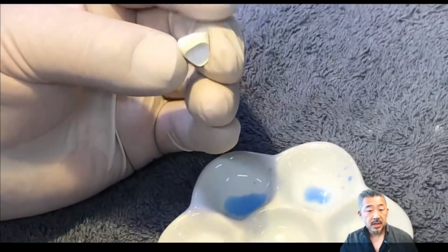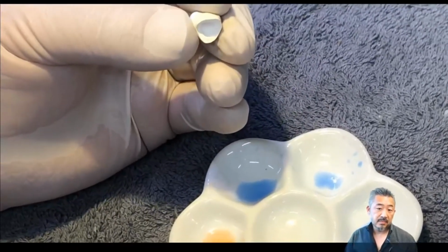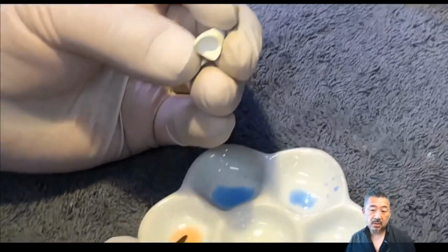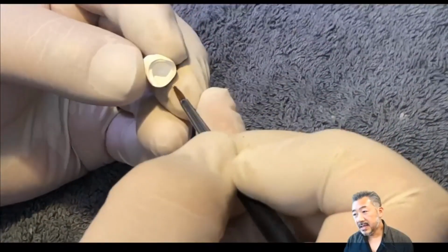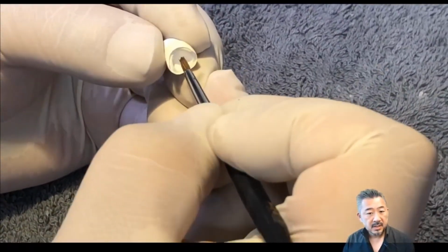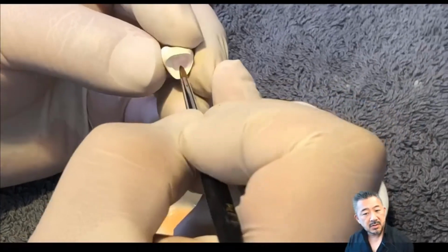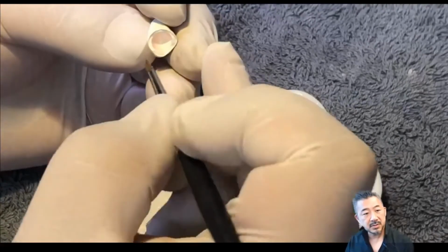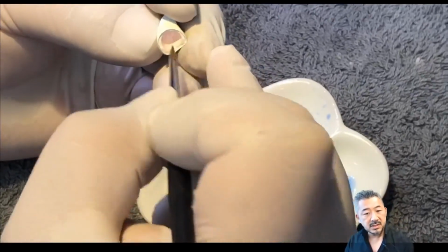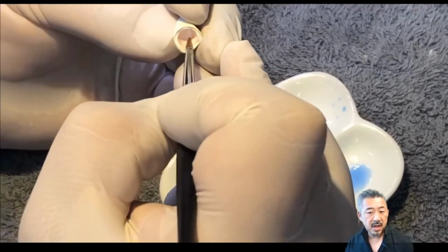If you don't use this, discolored cores or metal cores may badly affect the color tone. That's why I use it. But if you apply too much of this, the transparency of zirconia will disappear. So it's necessary to control the amount of stain.